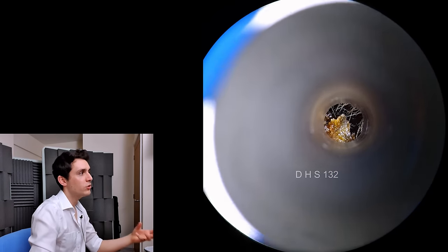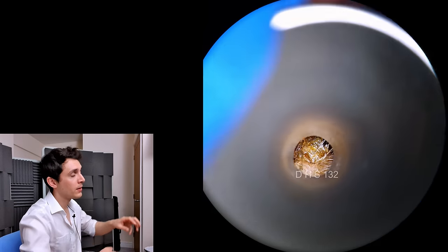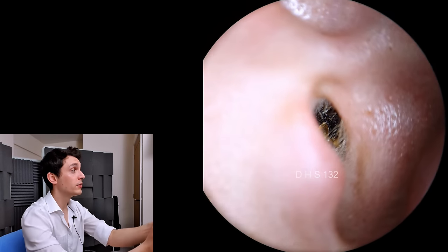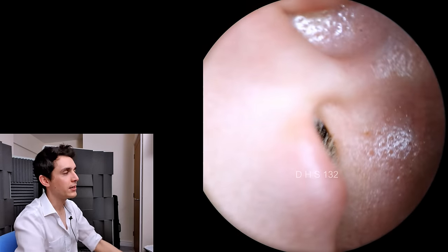Sometimes if you need to use two and you've got quite a deep impaction of wax, you'll use the first EarWay Pro and pull that out — then you've pulled the remaining wax away from the eardrum, so you don't have to be quite as invasive on the second time round.